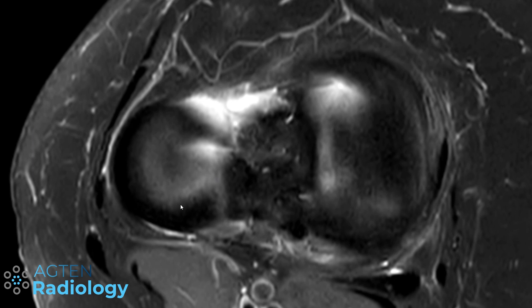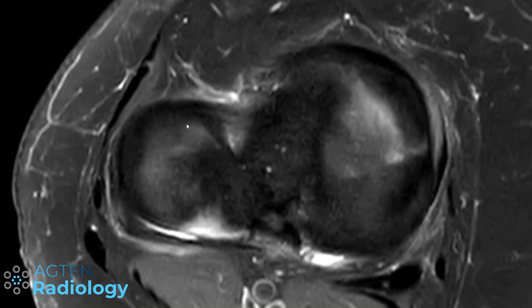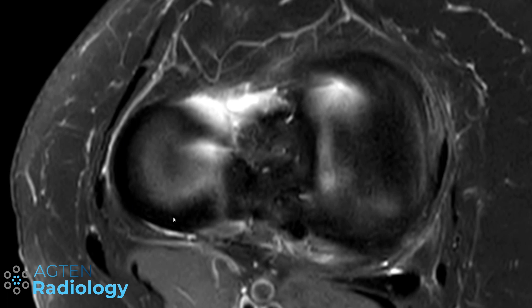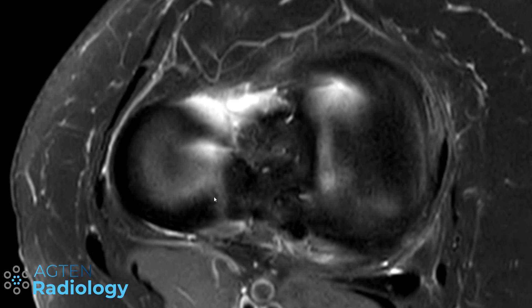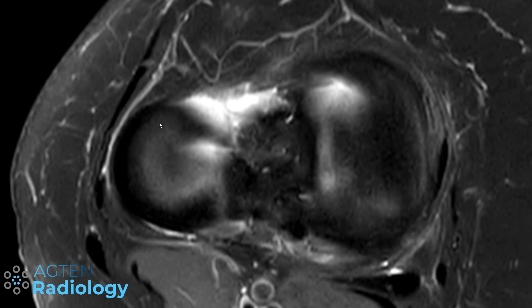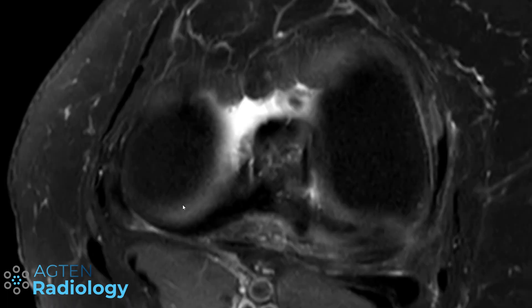You can see here on the lateral side where we have this quite nice looking meniscus. We can see it blacker at the base because the meniscus is thicker there, so there is less volume averaging. And when we go to the tip of the meniscus, it kind of fades out because the volume at the tip of the meniscus is brighter with the fluid and cartilage around it, so it's less dark.